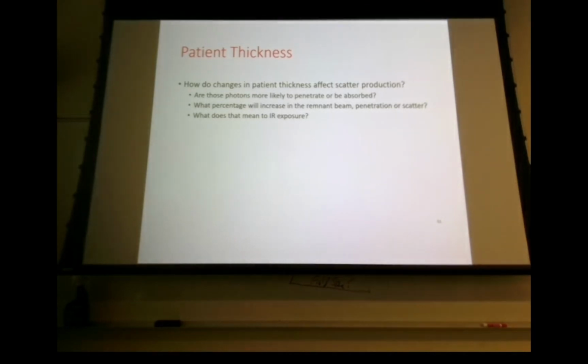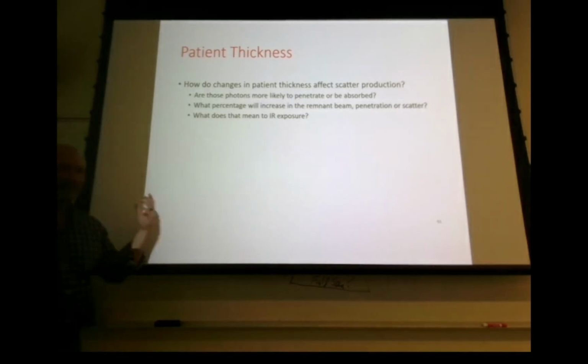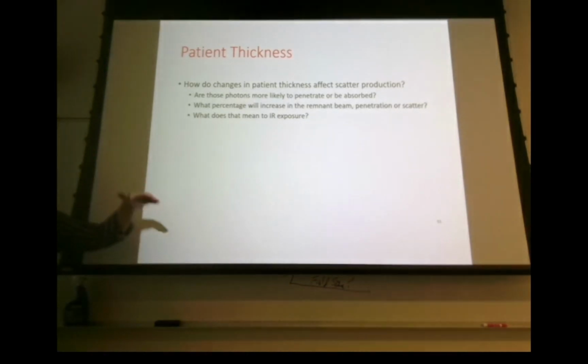Hypersthenic patient. So what you're gonna have a tendency to do is say, okay, I got a hypersthenic patient, they create more scatter radiation. Since they create more scatter radiation, scatter is a layer of fog, which is a layer of unwanted density. So scatter equals density, so hypersthenic patient, what do I need to do? Well, at some point you're gonna have a tendency to wrap everything around and say, it's density, right? So I need to decrease my technique. It's unwanted density. And no is the answer. Because most of that scatter is created inside of the patient, and it gets absorbed before it gets through the patient.